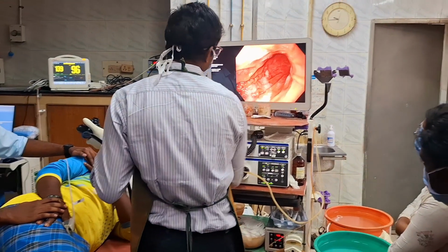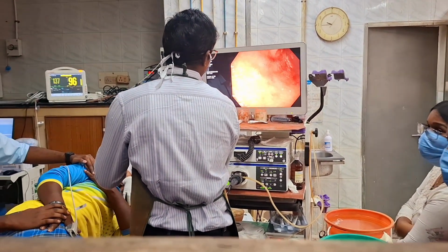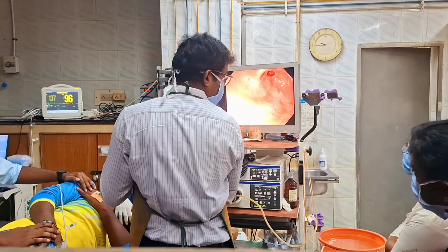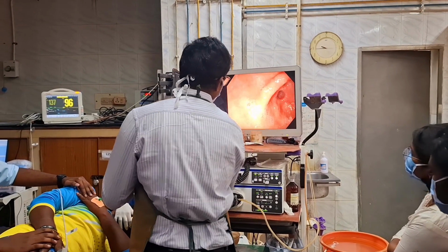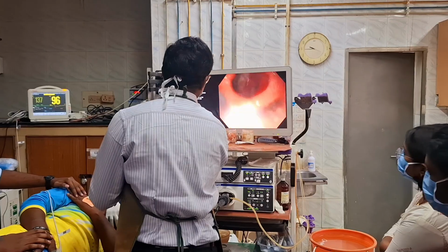Folds, which is greater curvature. Once you are in the body, you see rugosity. Okay. Next, you are seeing the opening there. This is the pylorus of the stomach. So this area will be the antrum of the stomach. So now we are entering via the pylorus.